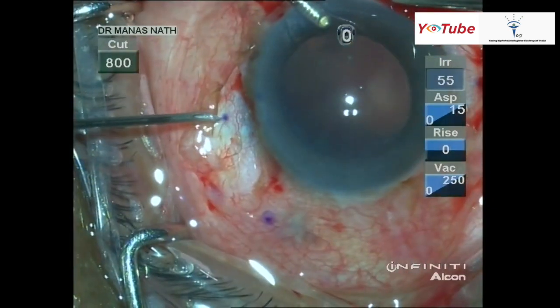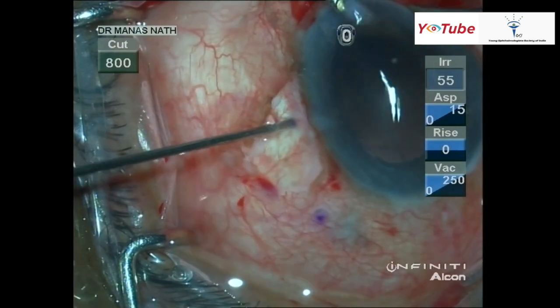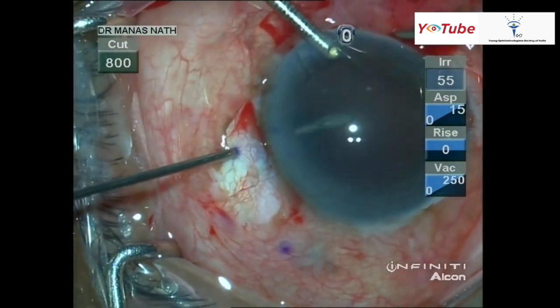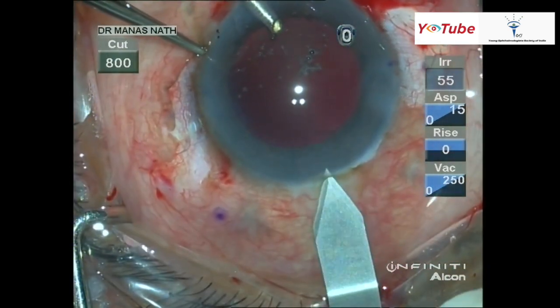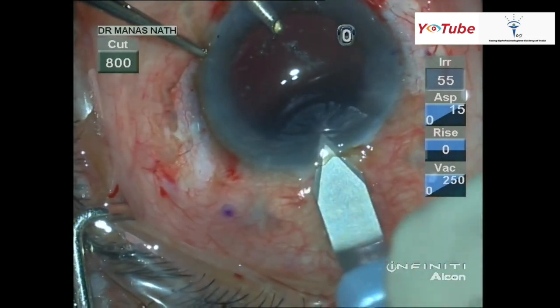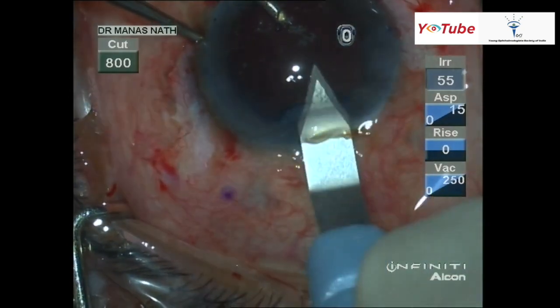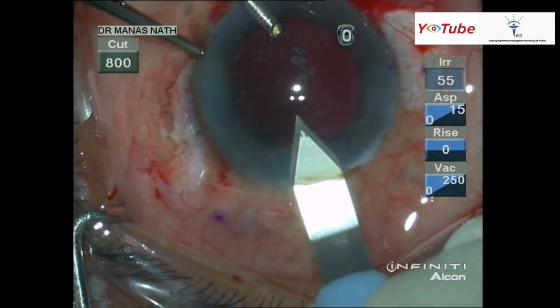The needle should be directed towards the vitreous, making sure it is not entering the anterior chamber. Now I'm making a clear corneal tunnel with a 2.8 millimeter keratome, and I will extend it a little bit so that I don't struggle during insertion of the cartridge.